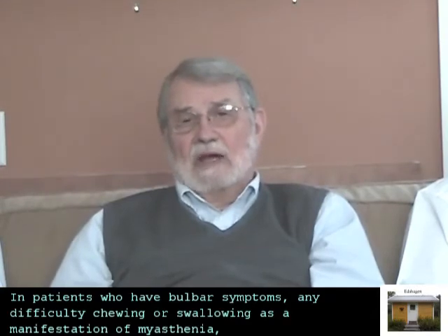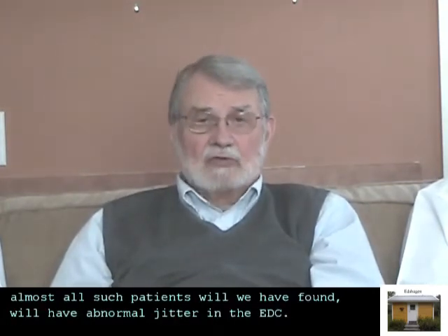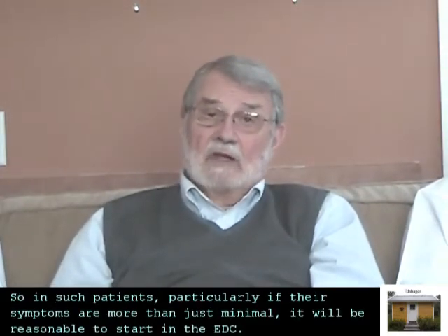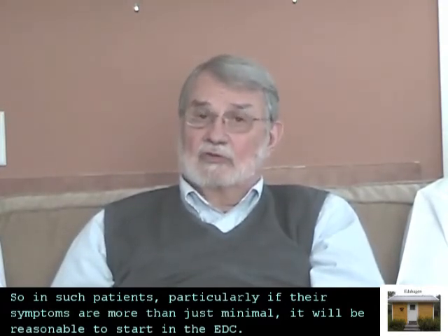In patients who have bulbar symptoms, any difficulty chewing or swallowing is a manifestation of myasthenia. Almost all such patients we have found will have abnormal jitter in the EDC. So in such patients, particularly if their symptoms are more than just minimal, it would be reasonable to start in the EDC.